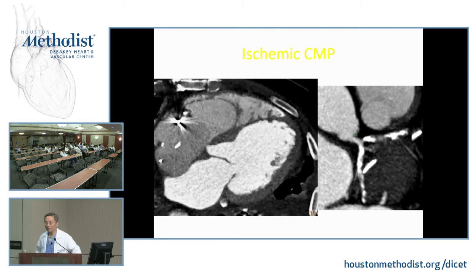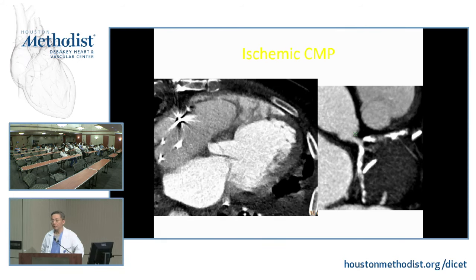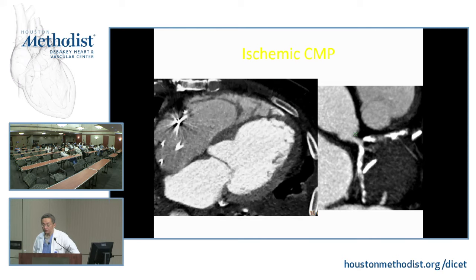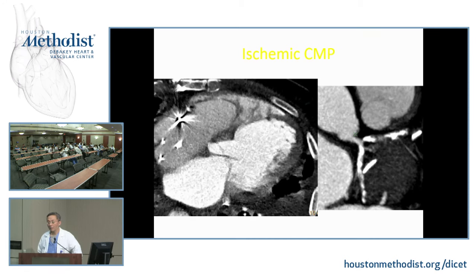So my practice is that if I see a lot of calcium, I stop there and send them to perfusion imaging. Even if you look at these studies, you showed the Gilrath paper. Gilrath did a very nice analysis in that paper looking at the diagnostic accuracy by calcium score. Your negative predictive value dips down to the mid-80s or even the 70s when your calcium scores start to become very high. So even if I see something there and I'm sure that I could pan it out, and now in the era of CT-FFR, there is still that hesitancy that I might be missing.